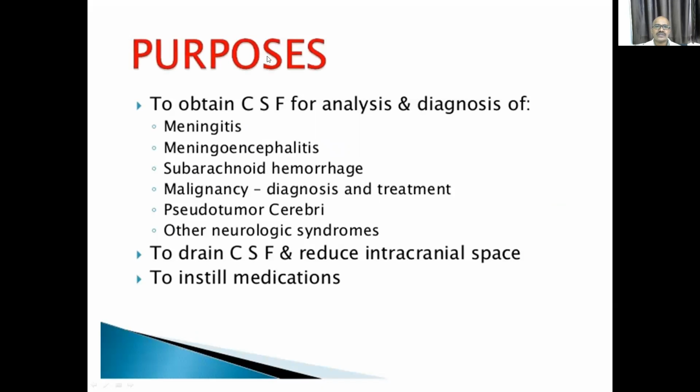So, the uses of the lumbar puncture needle. The lumbar puncture needle is used for obtaining CSF, cerebrospinal fluid, for analysis and diagnosis of meningitis. The indications for lumbar puncture are meningitis, meningoencephalitis, subarachnoid hemorrhage, and in malignancy, to know whether there is meningeal involvement or not.